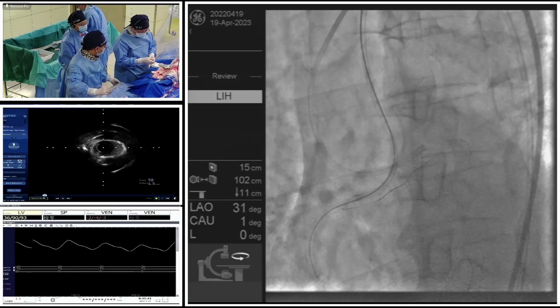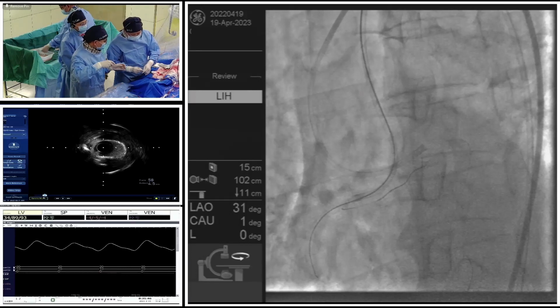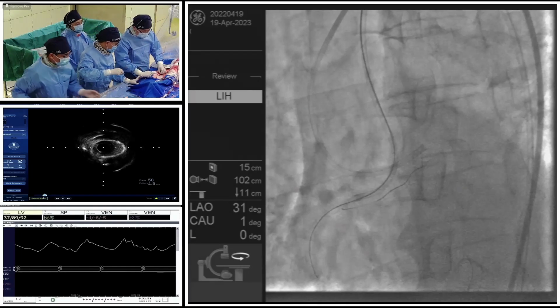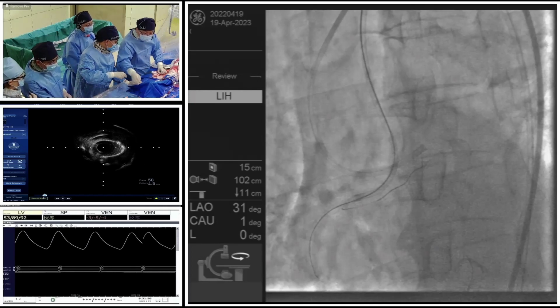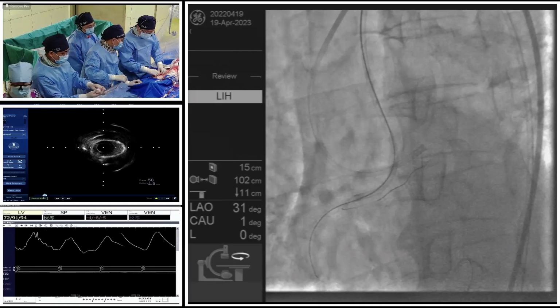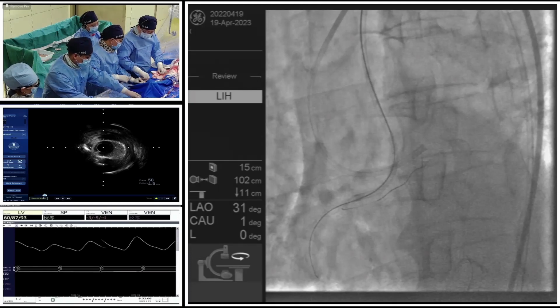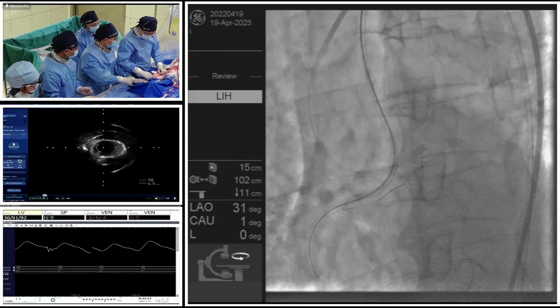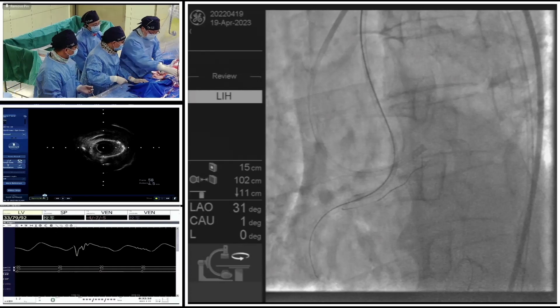Sometimes it could also significantly increase the puncture ability compared with a common microcatheter. So with the help of the dual lumen microcatheter, we can easily switch the direction of the second puncture wire to go into the more proximal area, next to the intraplaque area.